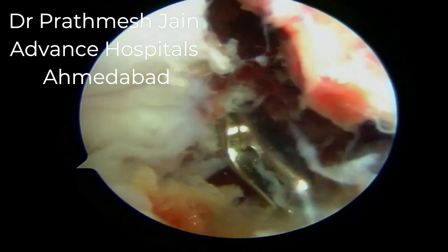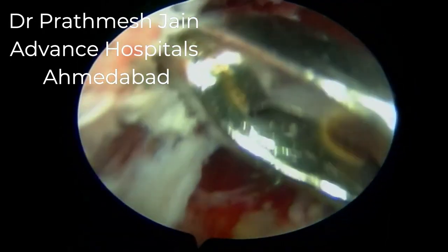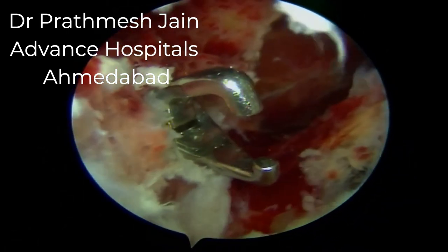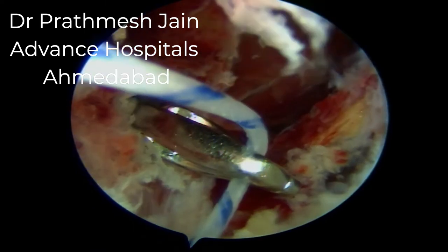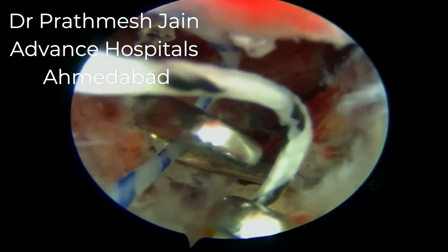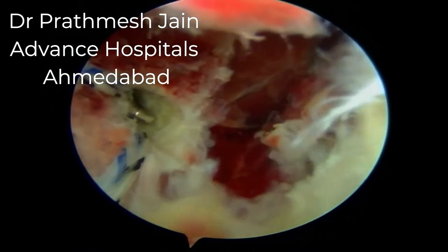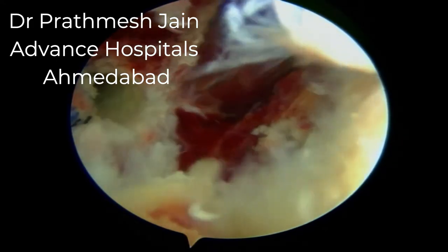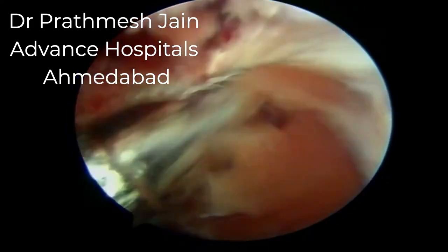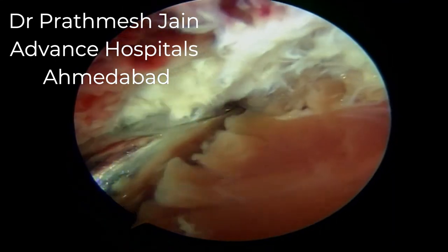Drilling is done under direct vision. We use knot pushers to feed the fiber wires into the suture retriever, passing one blue and one black suture wire through the retriever, then pulling both out on the anterior aspect of the tibia through the medial tunnel. We then shift our attention to making the lateral tunnel.